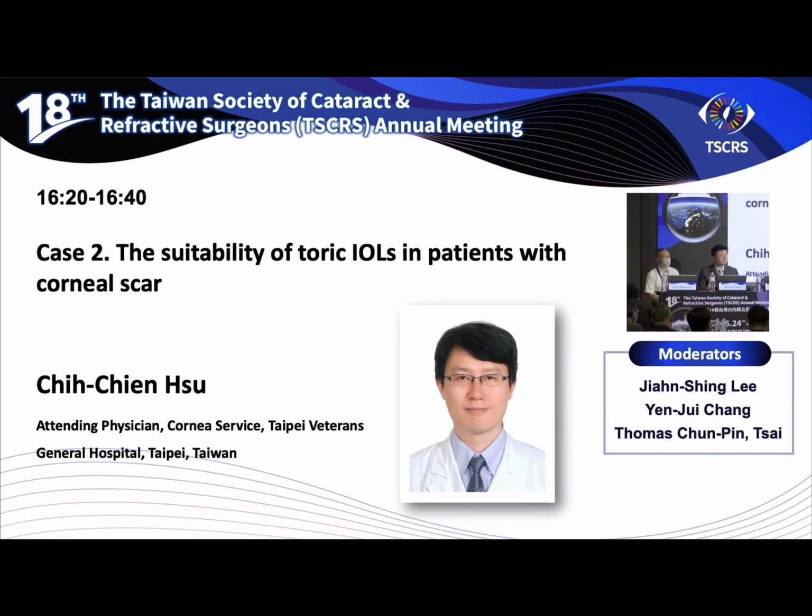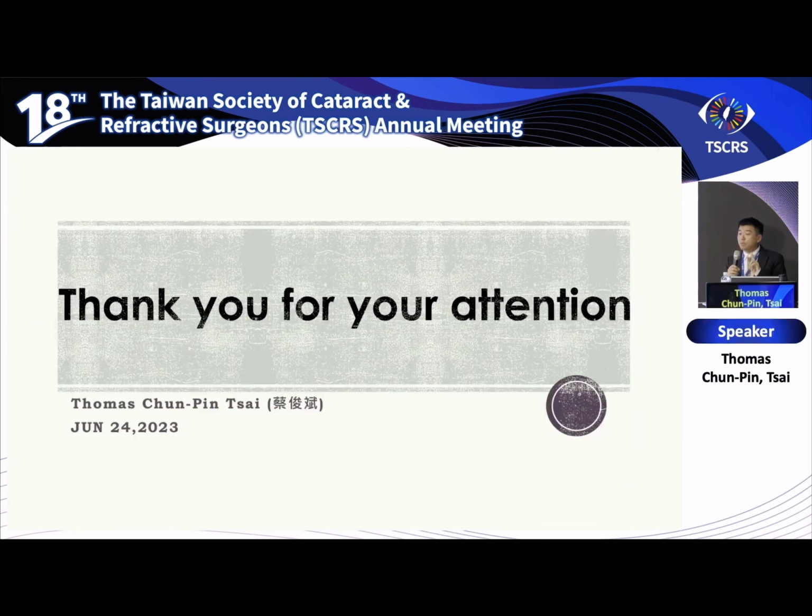Of course, there are many RK patients. We can see there are regular and irregular astigmatism. If you can see the bow tie pattern on your corneal surface, and you can give the patient some glasses for correction, and the patient says, "I get some improvement," then this patient may improve with a toric IOL. Sometimes I will ask the patient to give me back their old glasses.